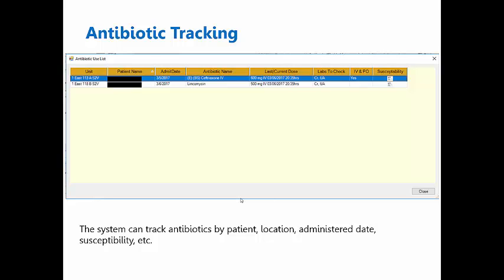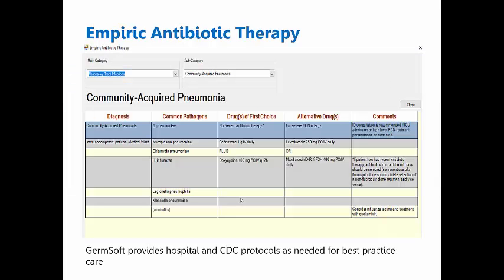And so having a mechanism where you can review each drug listed with the dates that they were changed and then the reference labs associated with those decisions is very, very helpful. I know sometimes that can be very challenging when trying to give feedback to practitioners about why did they choose A or B or C.